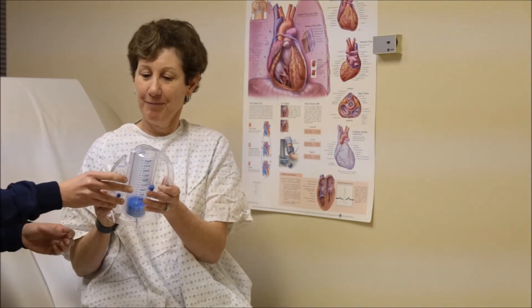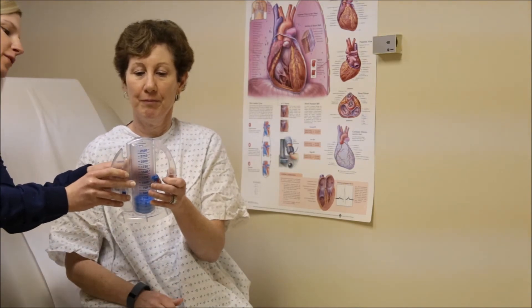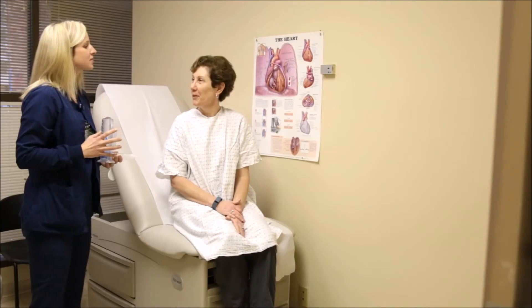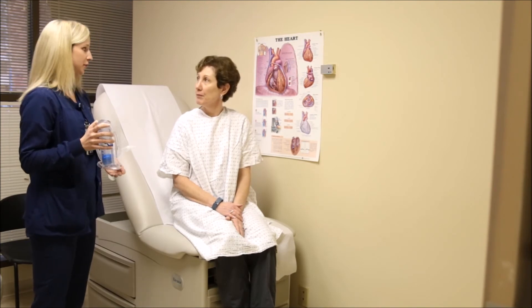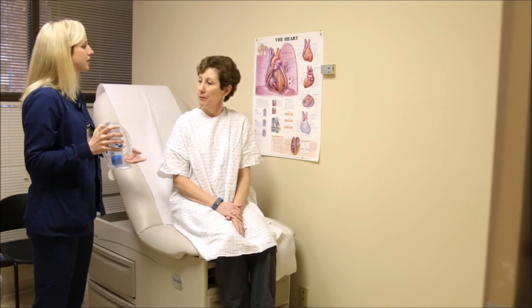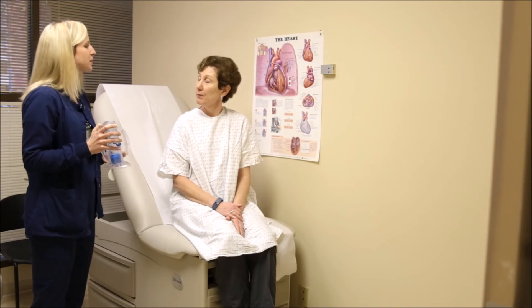So you got to about 1250, so I'll move it right up here for you. The goal is to do this about 10 times every hour while you're awake, and we want you to continue to use it once you go home as well.